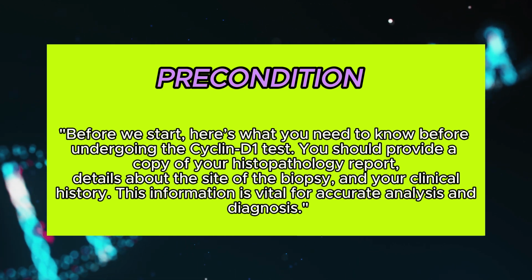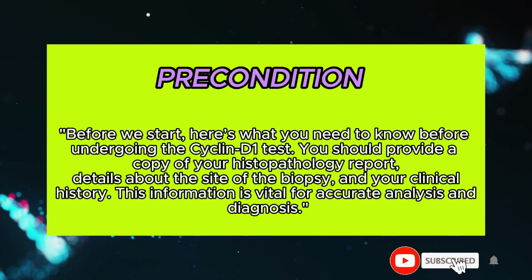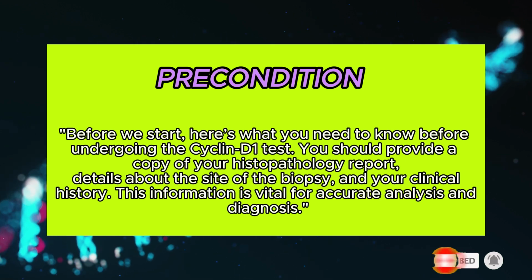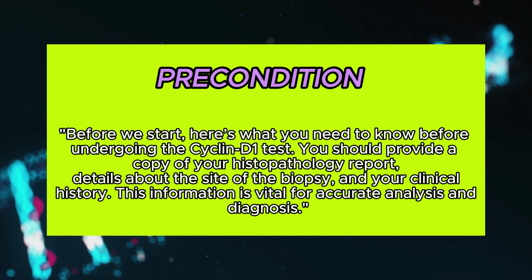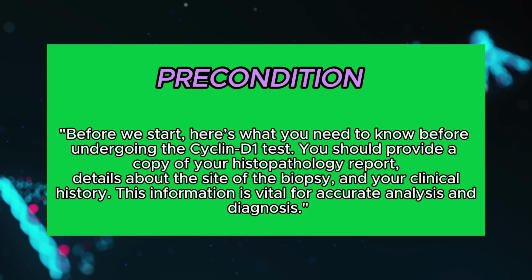Before we start, here's what you need to know before undergoing the CYCLIN-D1 test. You should provide a copy of your histopathology report, details about the site of the biopsy, and your clinical history. This information is vital for accurate analysis and diagnosis.